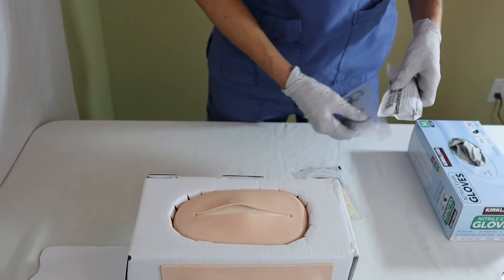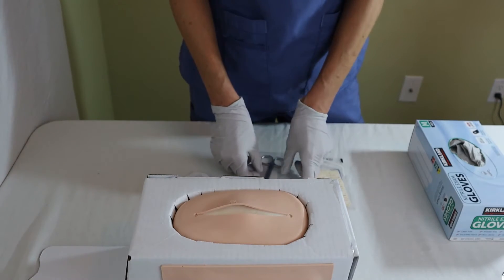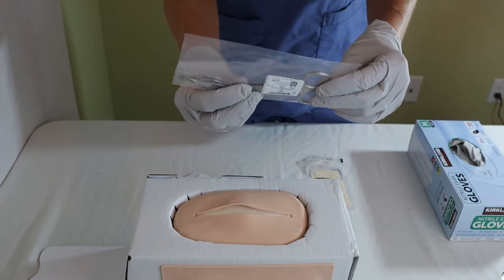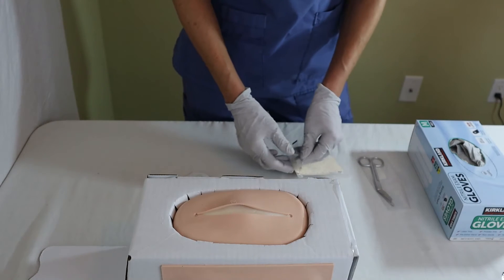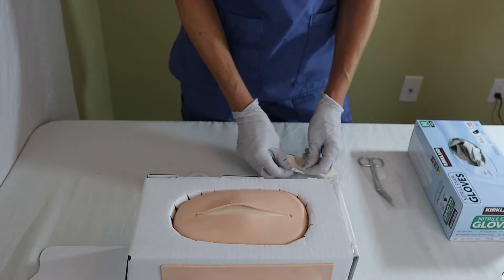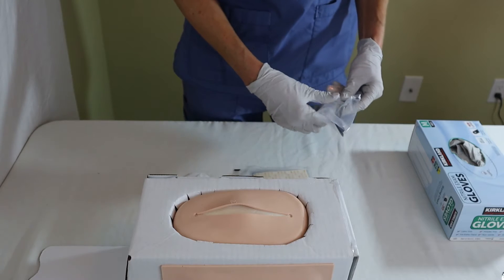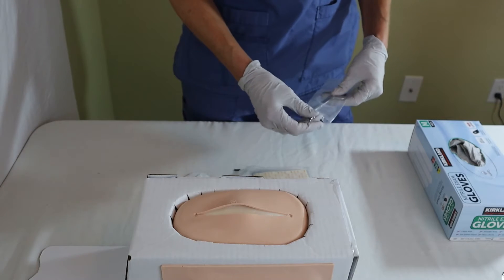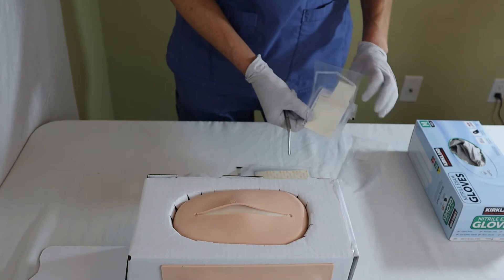I also want to make sure I have some cleaning solution to clean the wound with, and then some sterile scissors because I might need to trim the edges. The important thing is that I have sterile scissors because I don't want to contaminate the surgical wound that this patient has.